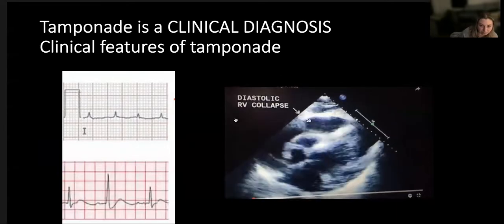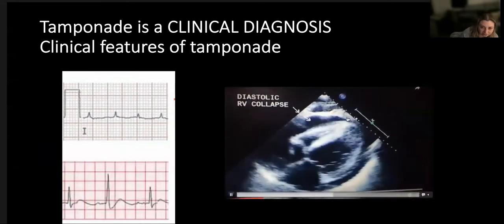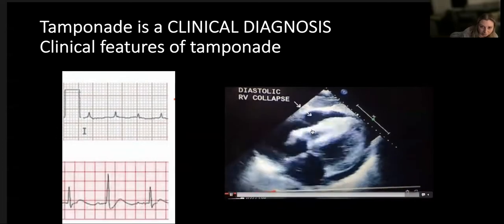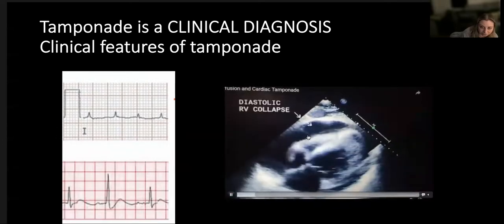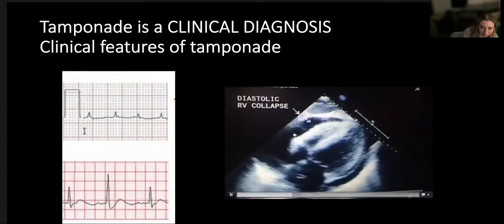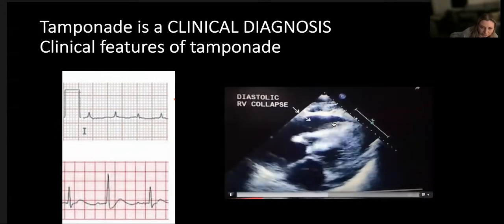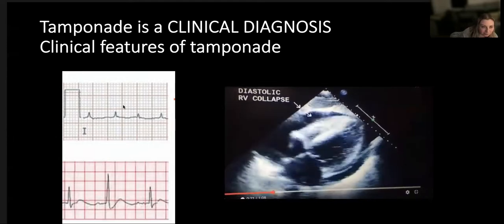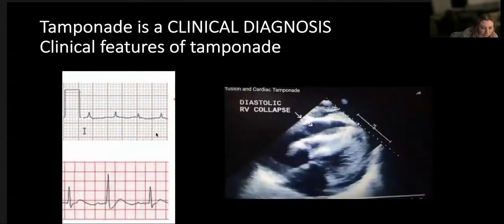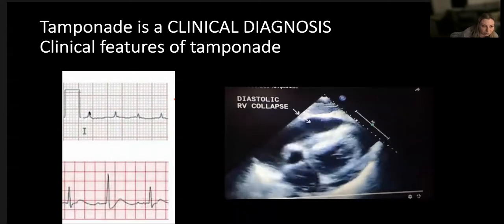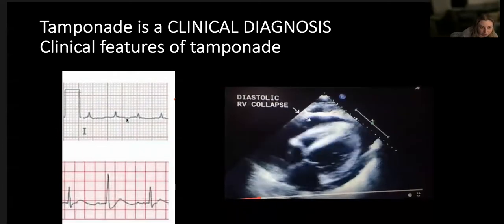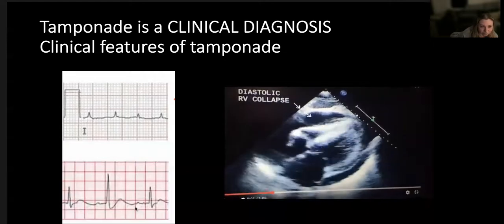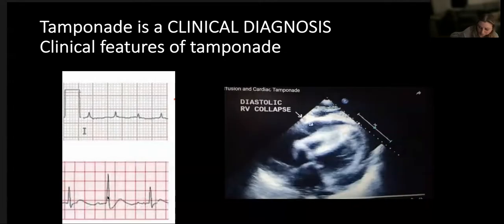Here we've got tamponade. We're going to talk about diastolic collapse in more detail. In this subcostal view, the RV on top is struggling to fill in diastole because of raised intrapericardial pressure. On the left we have ECG findings you might find as part of your assessment - low voltage complexes suggestive of tamponade and electrical alternans.